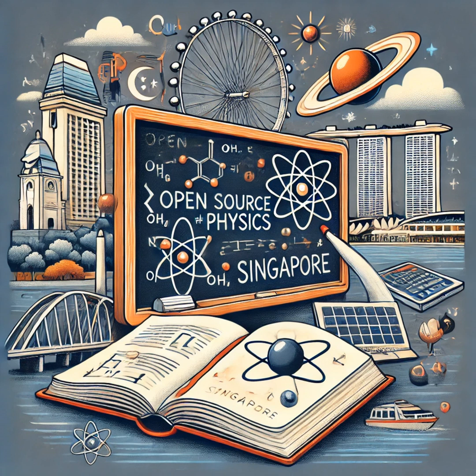They bounce around off of stuff. Yeah, they interact with the atoms in your body and change direction. So it's like some of the light from our flashlight is bouncing off objects instead of hitting the target. Exactly. And that's bad for the image, right? Yeah, scatter is basically noise in the image. It can make it harder to see what's going on. So we want to minimize scatter as much as possible.